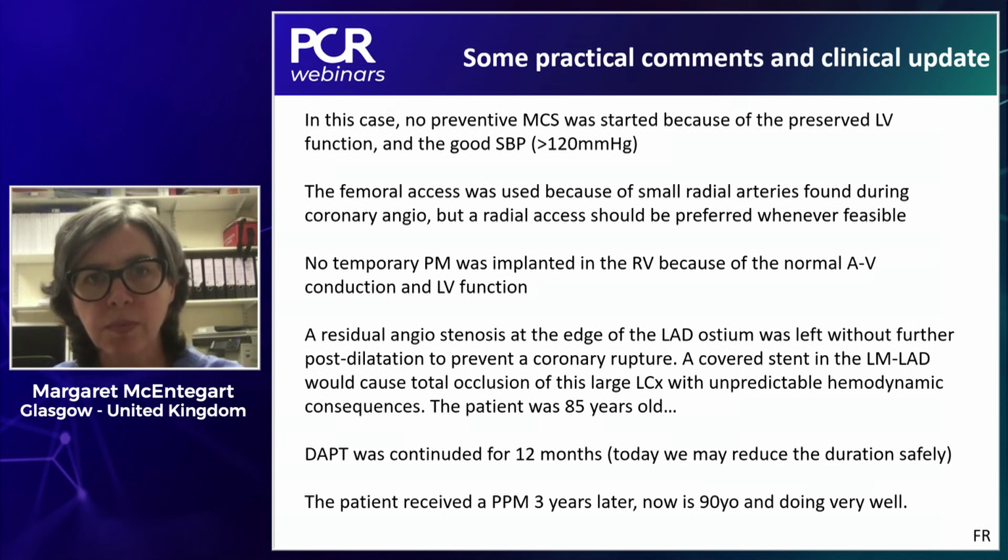Very well taken. I have a number of questions from the colleague. If you agree, I put them on the screen next to mine. Well, I think you somewhat already answered to this one, Margaret. There appears to have a malapose and underexpanded stent in the proximal LAD. What is your position? Because you are an expert imaging users. After this very challenging procedure, you see malapose stent struts, underexpanded stent struts. What is your position on that?